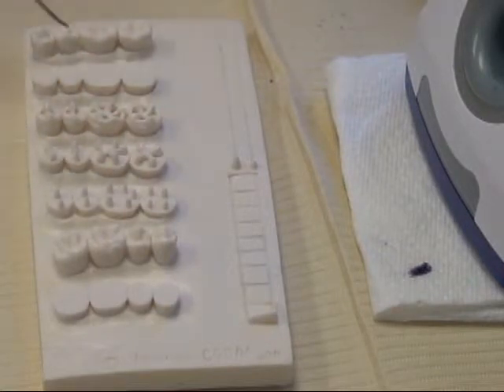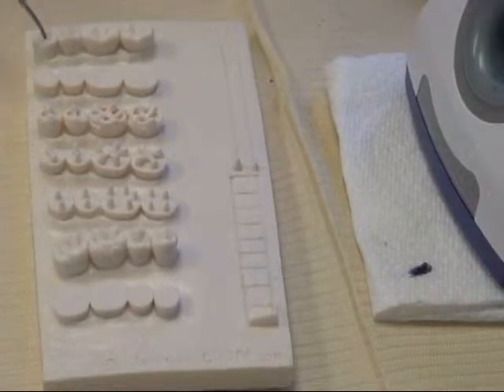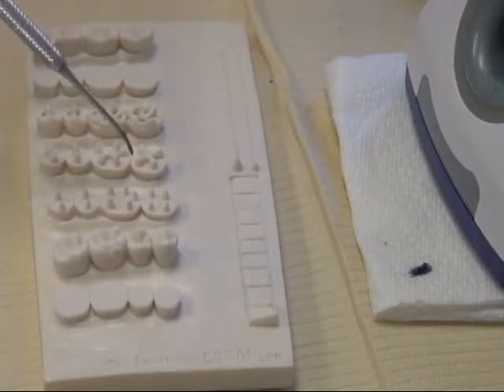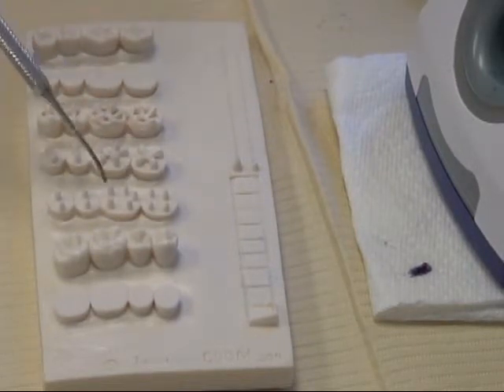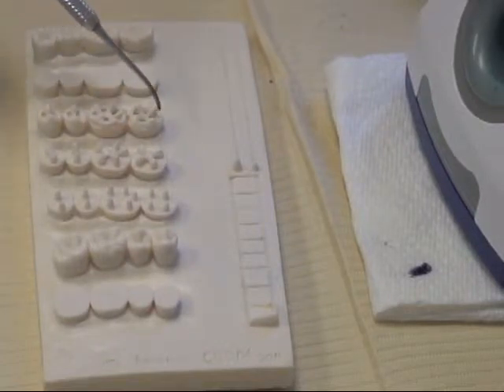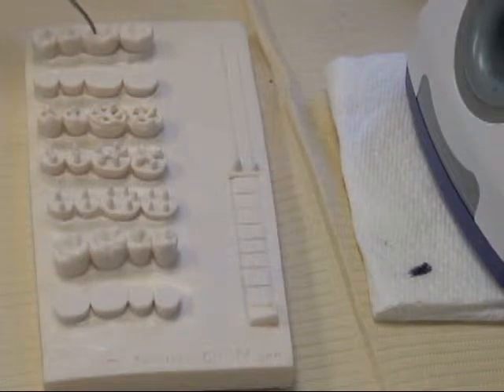This happens to be this set of teeth, which is the lower right molar area. This is tooth 31, 30, 29, and 28. These are the same teeth that have been cut off flat. You add cones where you want your cusp, then you connect the cones with your triangular ridges, and then you put in your marginal ridges and your circumferential aspects of the tooth, and then you do your final wax up to make it look like the natural teeth.